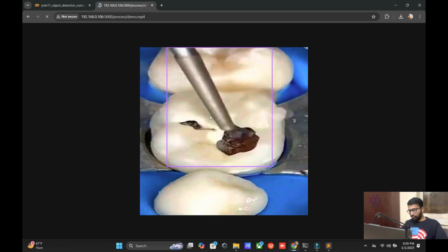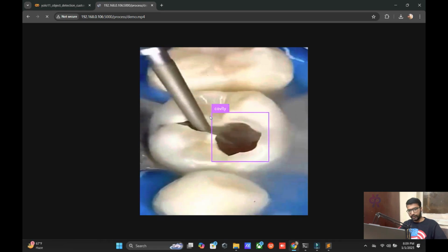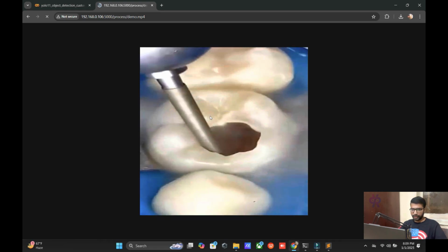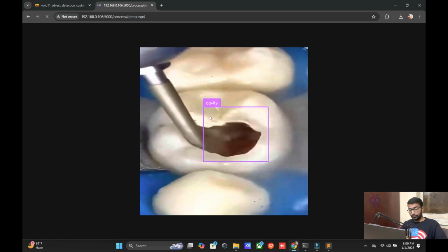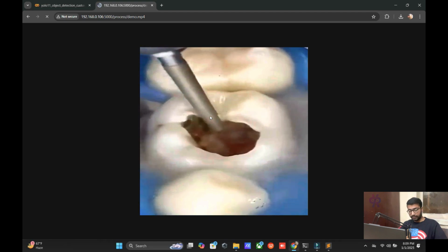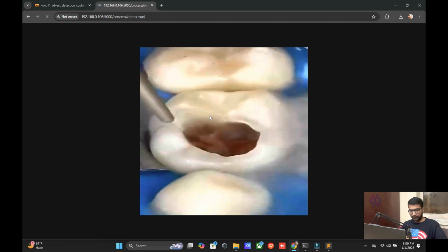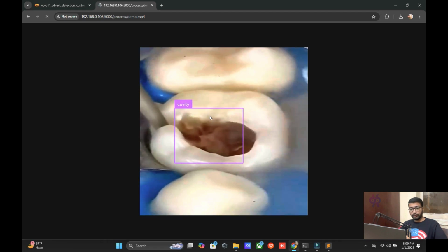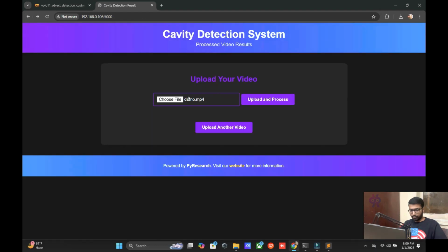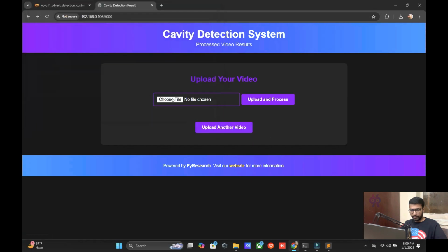So in this video we learned how to customize our medical AI project, cavity detection, and we also saw the interface, how to attach our model to the interface and see the result, and also how to install the dependencies. Okay, and here I'm going back to upload another video and clear it.